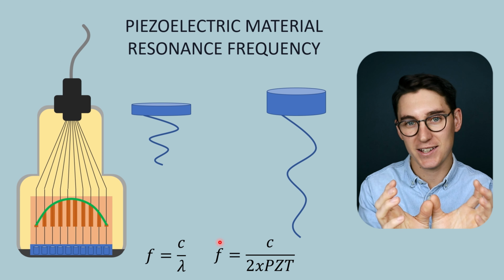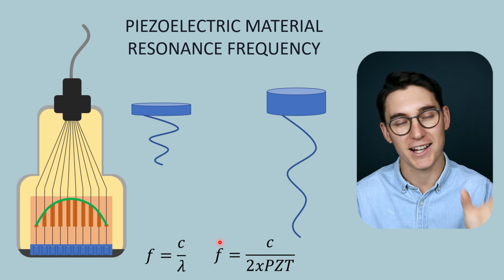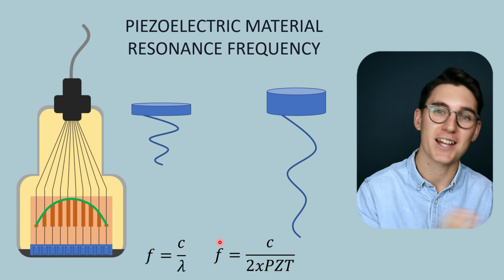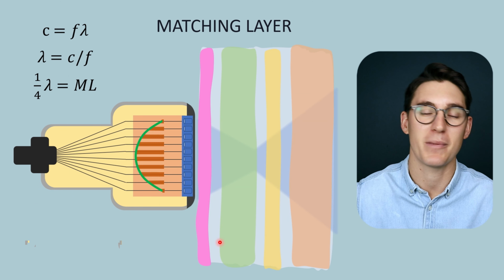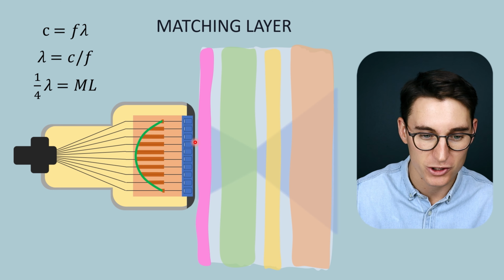Now, the difference in the acoustic impedance values of our piezoelectric material and our tissue boundary is quite high. And we need something to smooth that transition, coming from a high-speed piezoelectric material to a lower-speed soft tissue. And that's what's known as the matching layer. Now, the matching layer is the front end of our transducer here.